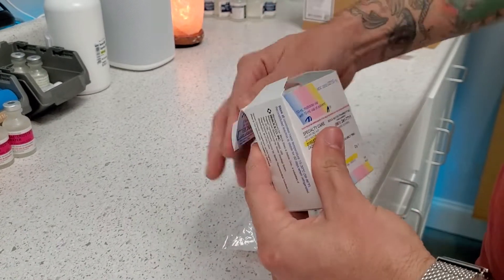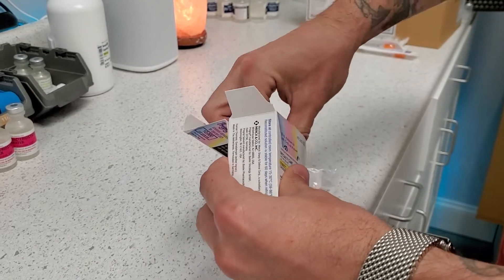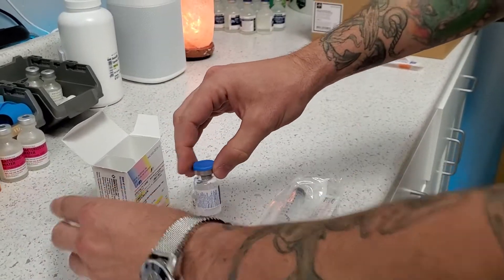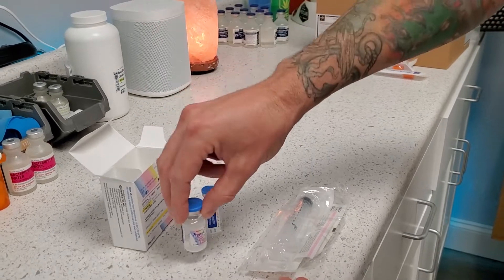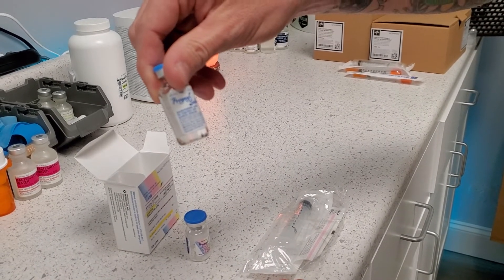Step one, we're just going to make sure that everything's included. You should have two vials in here. One of these is the Pregnal powder, and then you're going to have some saline, or bacteriostatic water.